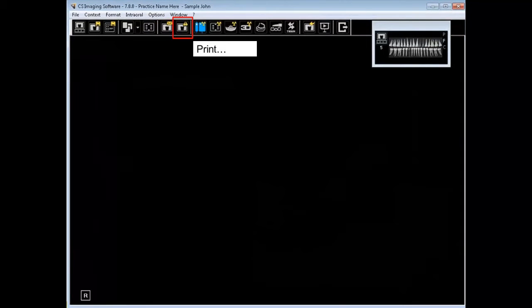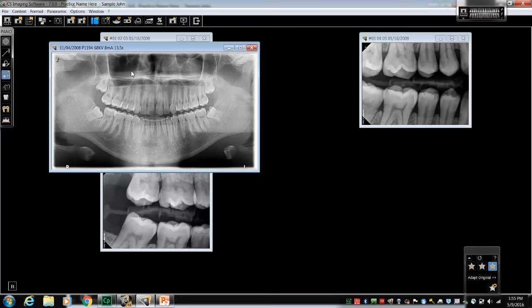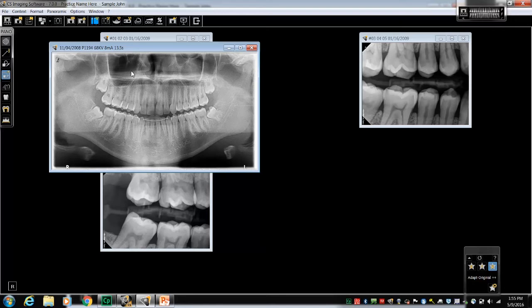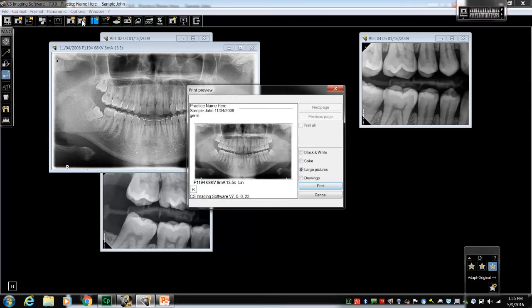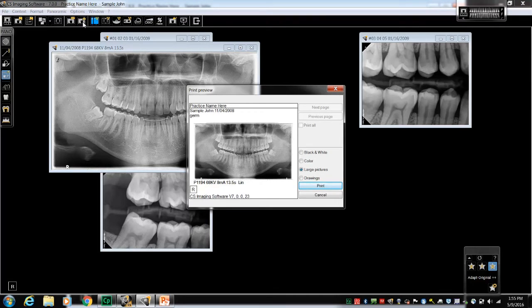From this option you can print a single periapical, you can print up to four images on one page, or you can print images in a mount. Let's take a look. If the pan image is open, you can select the print icon from the main toolbar and the single image will print to one eight and a half by eleven piece of paper.